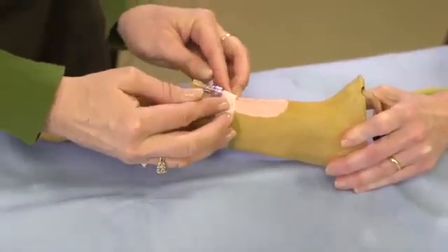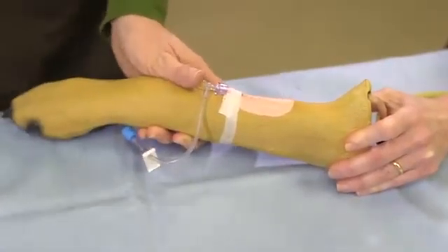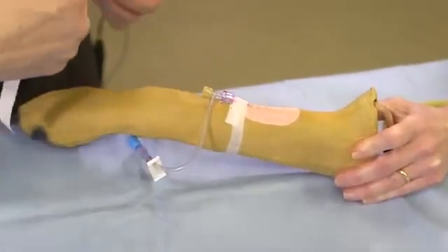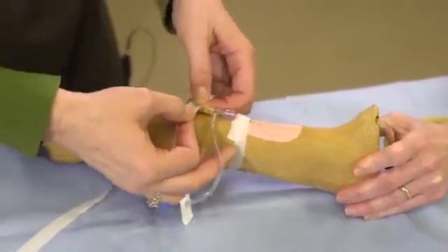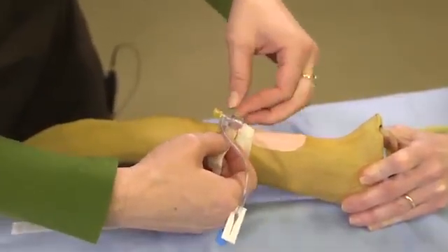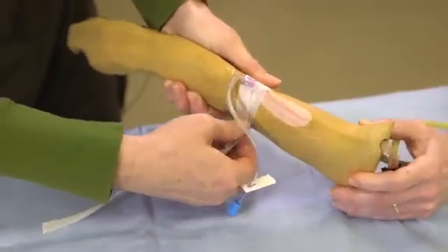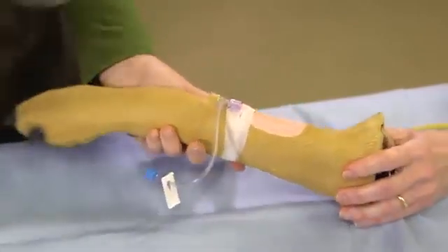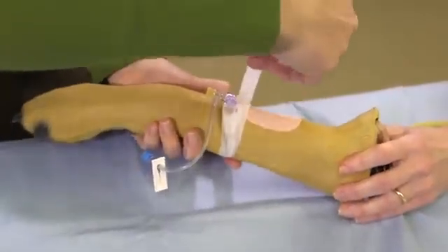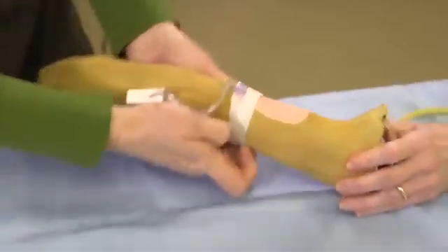Make sure this is really nice and secure, but not too tight. Another piece of tape, sticky side down. You go under your catheter. Take this piece of tape, stick it onto that other side, and around. And it's much easier when you have this nice still patient and it's not moving around.